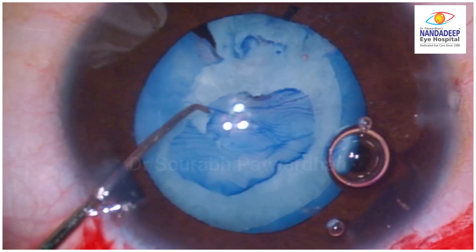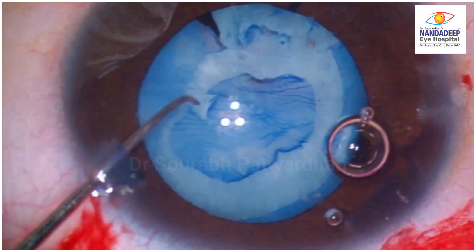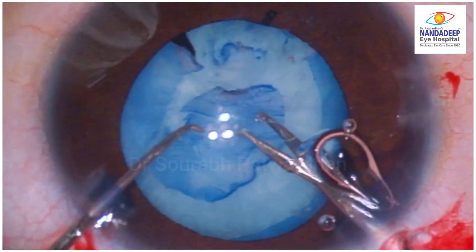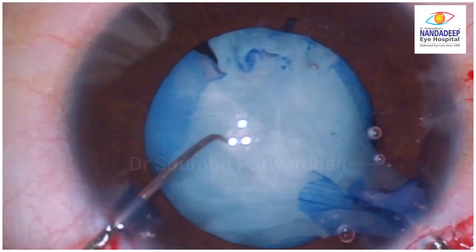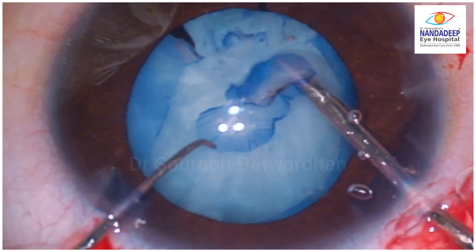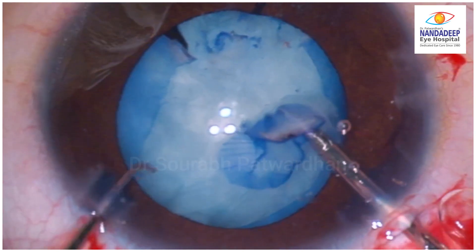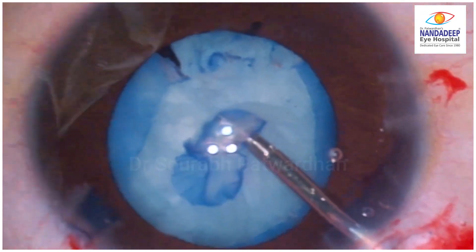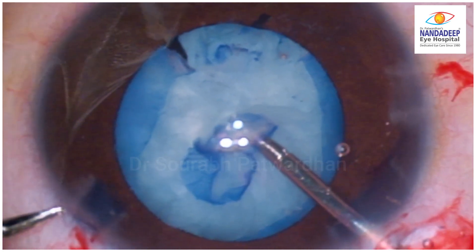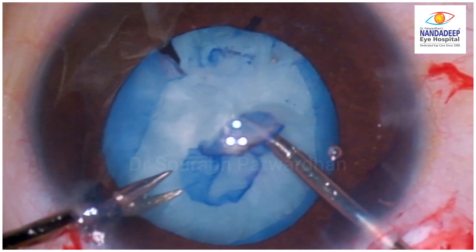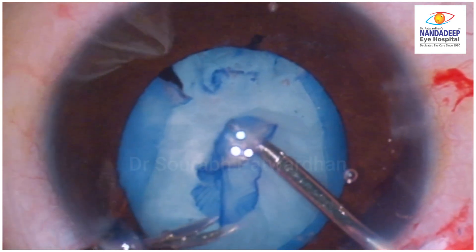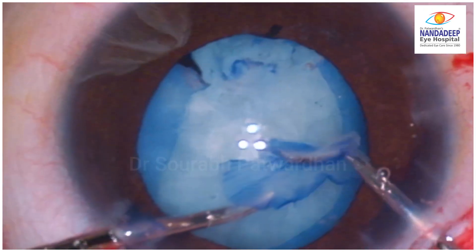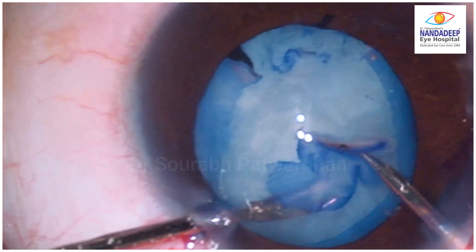We can also use a vitrectomy cutter at high speed and low vacuum to trim it. When I try to remove the anterior capsule you can see it is still attached — the subcapsular fibrosis was going to the periphery. Luckily there was no extension, and instead of trying to pull it completely I am cutting this fibrosed area to release the capsule and remove it without pulling the peripheral capsule.